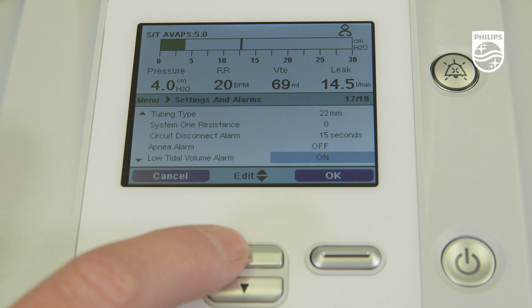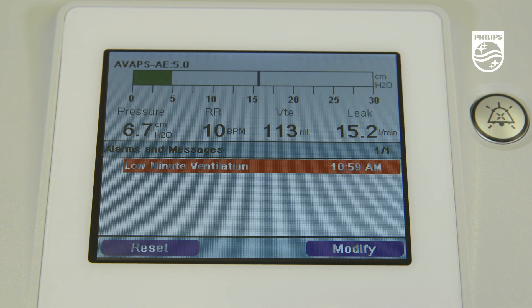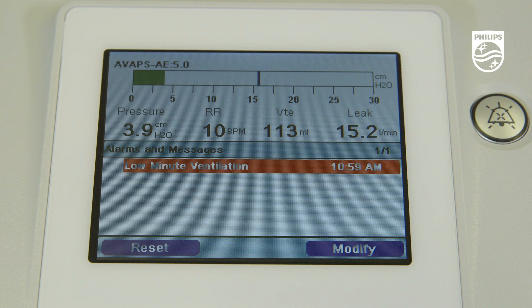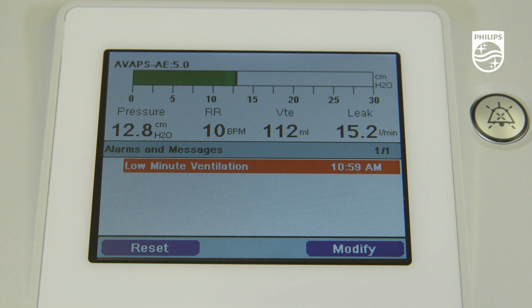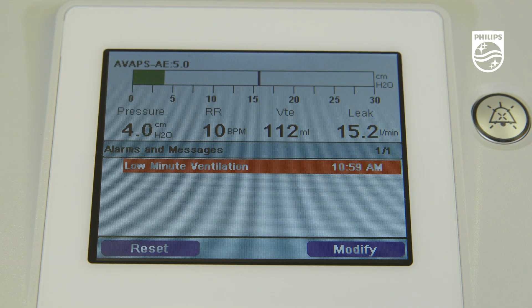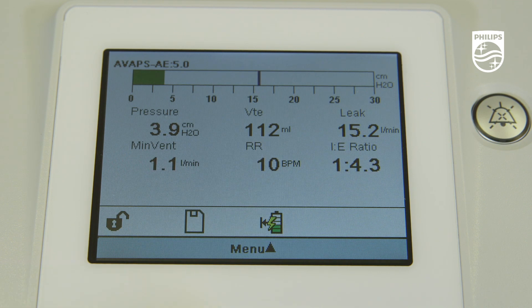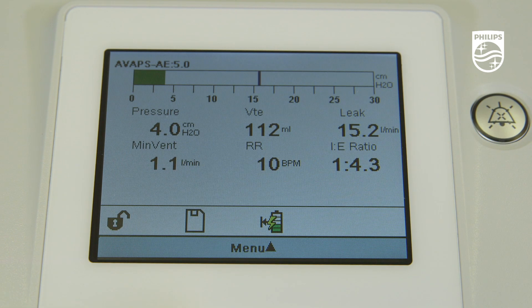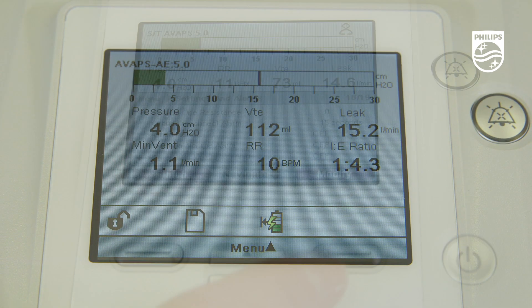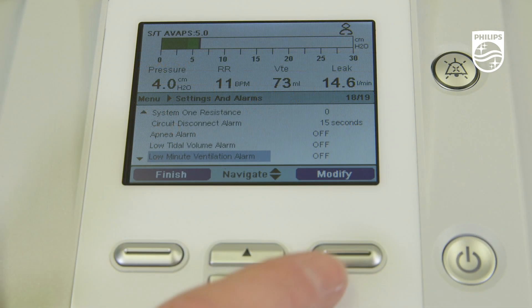The low tidal volume alarm is a high priority alarm that occurs when either the AVAPS or AVAPS AE mode is enabled and the target tidal volume cannot be reached. Once the target tidal volume is reached, the audible alarm will terminate.